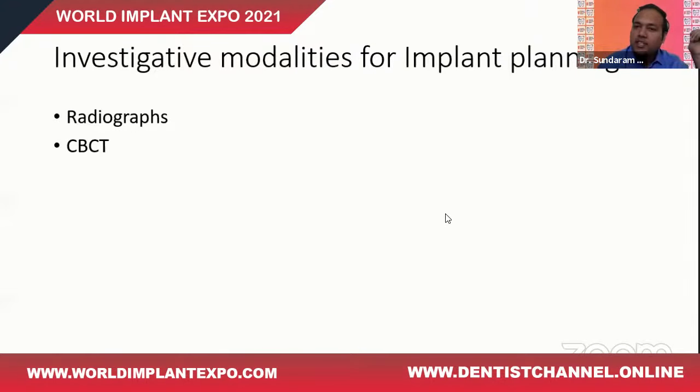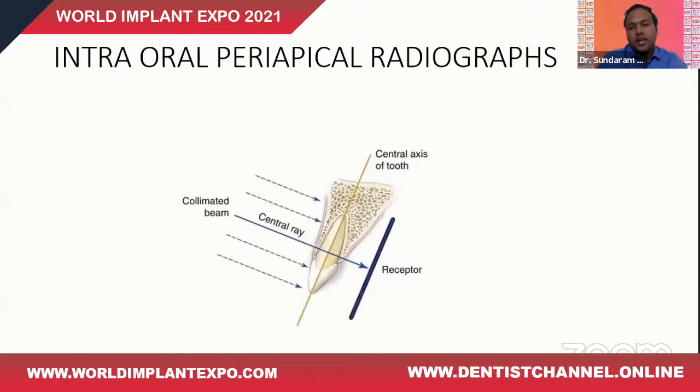So what investigative modalities are available for implant planning? It is the regular radiographs, and of course the most recent one, the CBCT. In radiographs, what do we have? The most routinely practiced are the intraoral periapical radiograph and the orthopantomograph. As you can see in this picture, this is a diagrammatic presentation of how an intraoral periapical radiograph has its own principles.